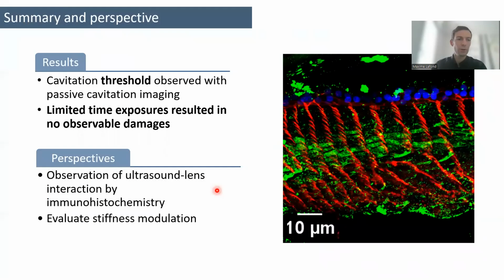So as a conclusion, we showed the cavitation threshold observed with passive cavitation imaging and used that in ex vivo lenses. We observed that limited time exposure resulted in no observable damage. Perspectives for the study are to observe the ultrasound interactions using histochemistry, as well as to evaluate the stiffness modulation using the shear wave elastography that was developed in this project.